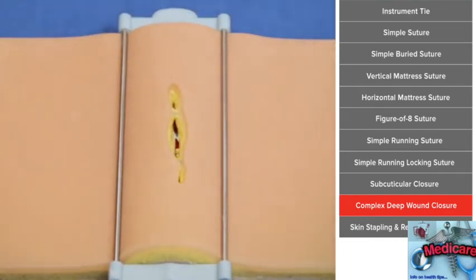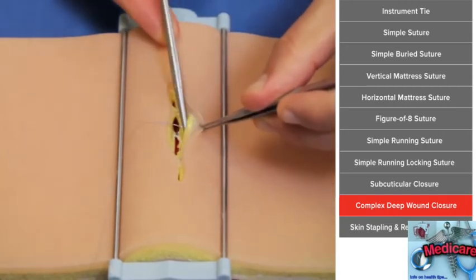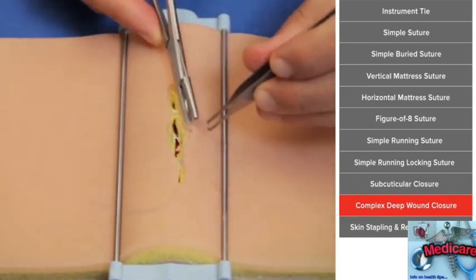If you sort of sneak up on it though and start closing the ends first, you'll take the tension off, so by the time you get to that middle stitch, it'll have the least amount of tension on it. So here we have 2, and I'm going to put 1 more.